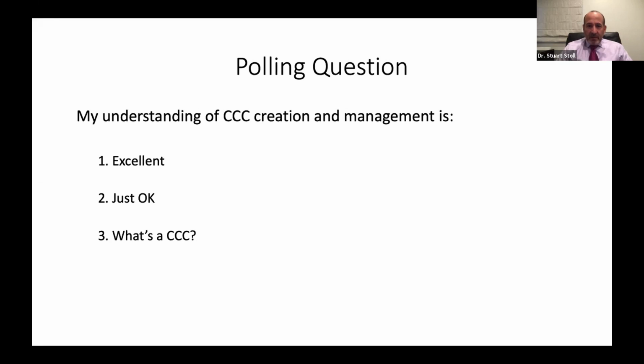So excellent is 6% on understanding of CCC creation and management. Well, that's fantastic. And just okay, we're hitting 81%. And what's the CCC? 13%. So it sounds like we've got the right audience here. So we're targeting newer surgeons, I should say, or people that are starting the CCC.